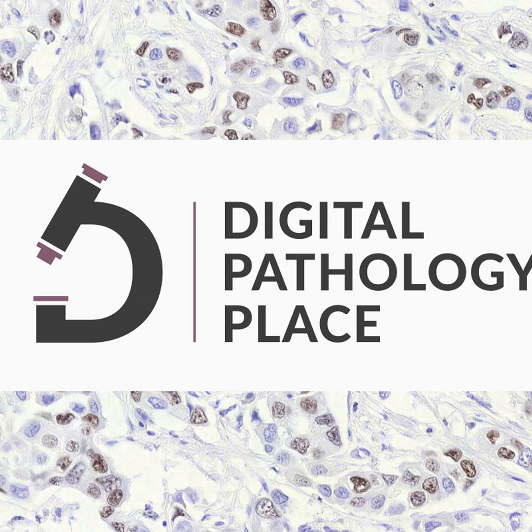Whole slide images, we know what they are. They are high-resolution digital images created by scanning the entire glass slide, at multiple magnifications. They are the cornerstone of digital pathology, right? But they are also being used in neurology, veterinary medicine, shout out to all veterinary pathologists, hematology, microbiology, dermatology, pharmacology, and toxicology, shout out to toxicologic pathologists, immunology, and forensic science.